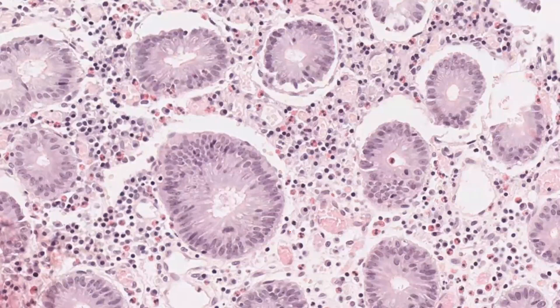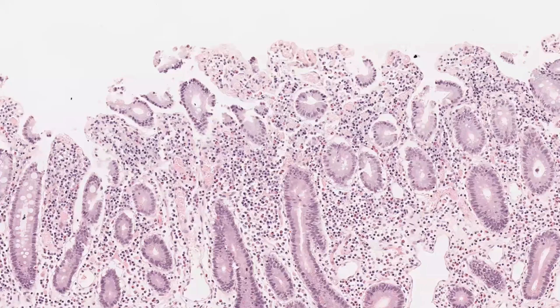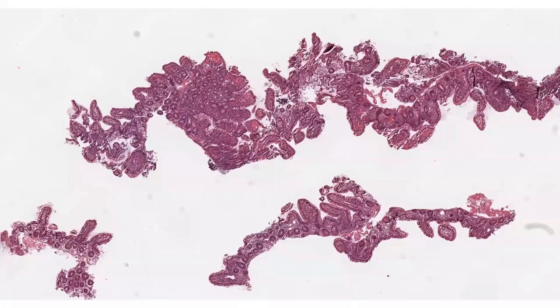But you need to apply the score then, and then you will be able to say, okay, I'm scoring the chronic inflammation at this, the acute inflammation at that. The surface you will judge. Do you think there is ulceration? You don't think there is ulceration according to this, and you will then score. So I will take you to another case. Again, this is a pouch biopsy, okay? So, okay, where is it, right? If I tell you, right, this is from the pouch itself, okay? So this is the question that you have always to ask me.